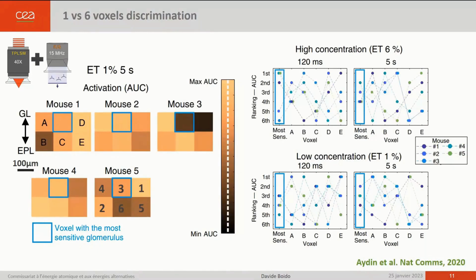And again, this does not depend on the odor concentration or duration. It does not depend either on the chosen parameter, because we also tested, for example, a general linear model approach with similar results. In other words, because of the enlargement of the neuronal activation spot made by the vascular integration, we cannot map the activation as precisely as we wish.